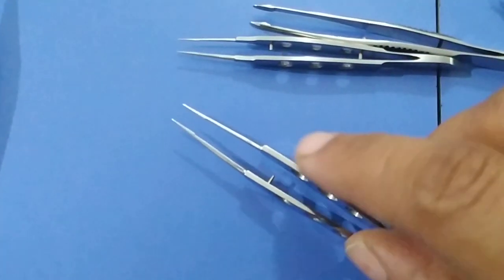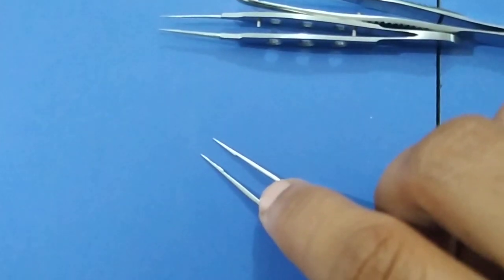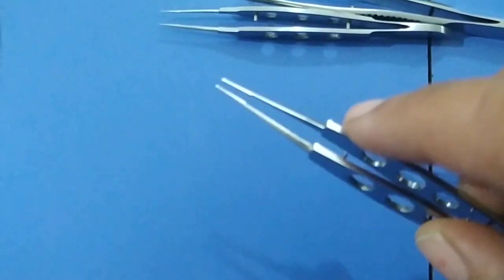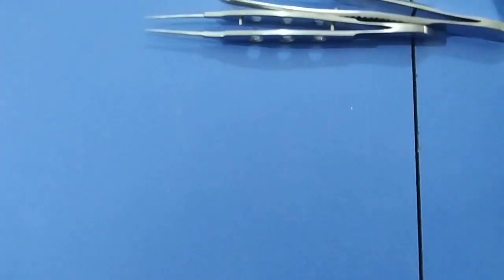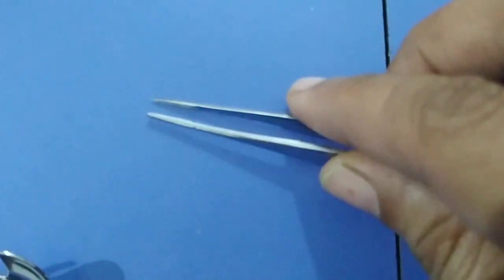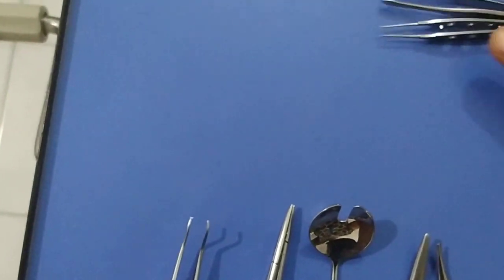This is a straight tying forceps. It is used to hold the fragile conjunctiva during any type of surgery, and it is also used to tie sutures along with the Macpherson forceps. It is also used to hold the thin scleral flap during trabeculectomy. This is a muscle holding forceps, used to hold the extraocular muscles during retinal detachment surgery.